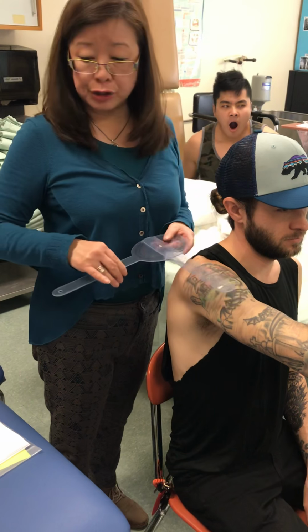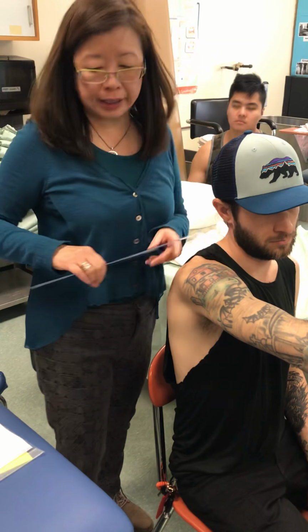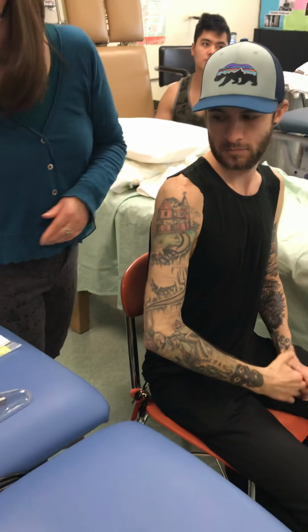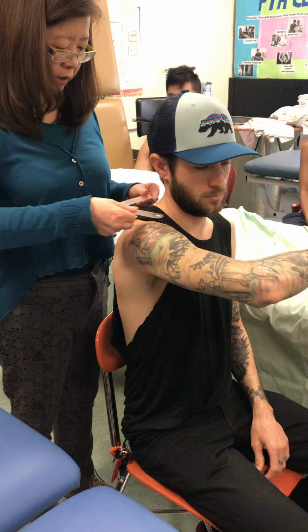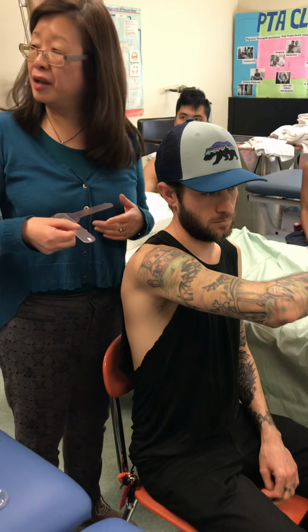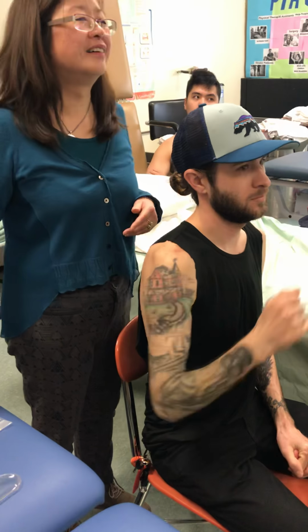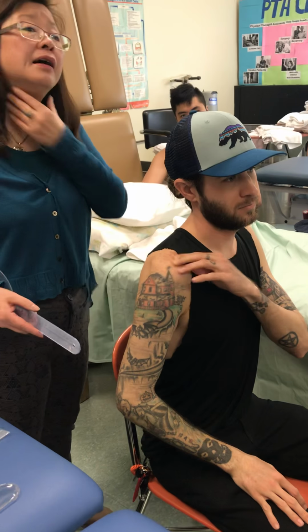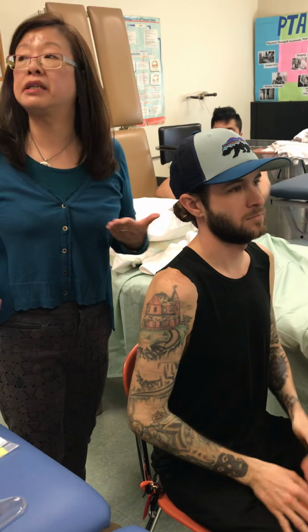I can use a smaller goniometer. It sometimes can work if I use a smaller one, but that one I could tell is probably not going to fit. You can try to do this, but it might still get in the way. People don't like stuff on their neck. Why don't people like stuff touching their neck? Danger zone. It's a danger zone. Certain areas of the body are danger zones. You need to be careful.